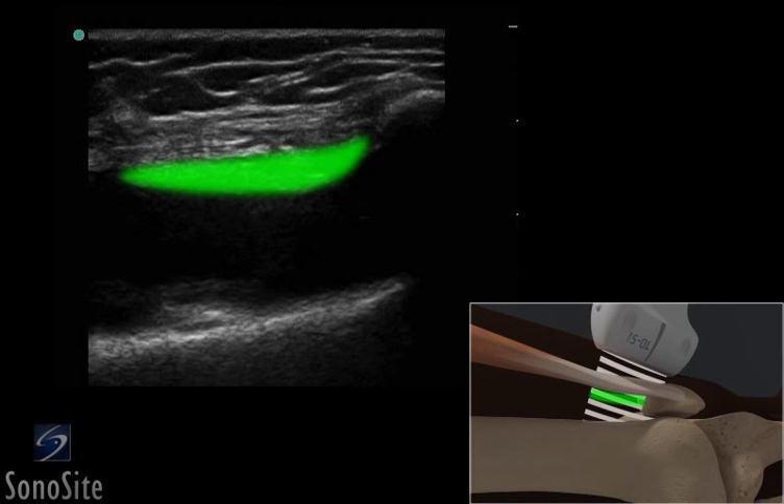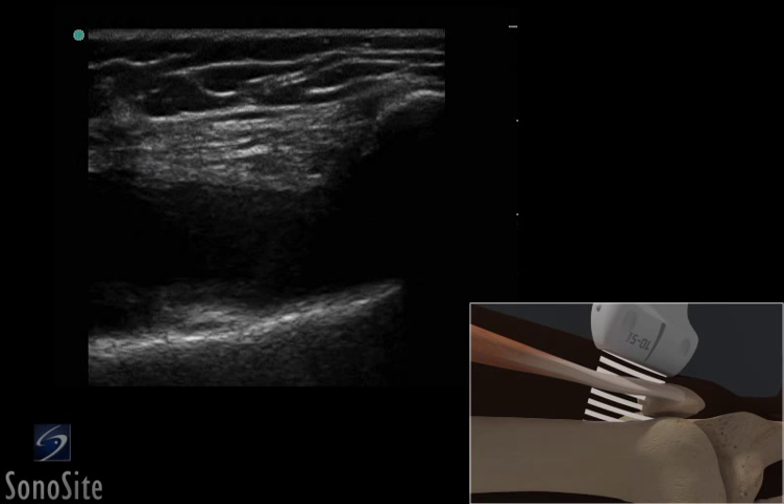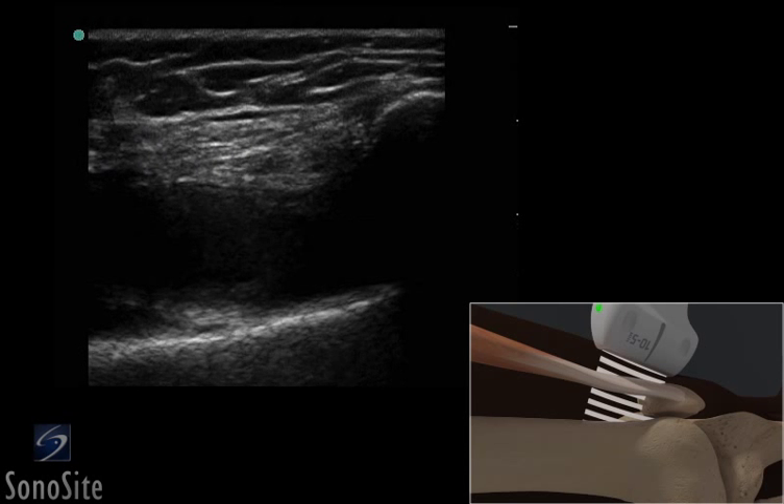The suprapatellar fat pad and the darker, hypoechoic suprapatellar bursa can be seen in this image. This bursa may not be visible in the absence of an effusion.